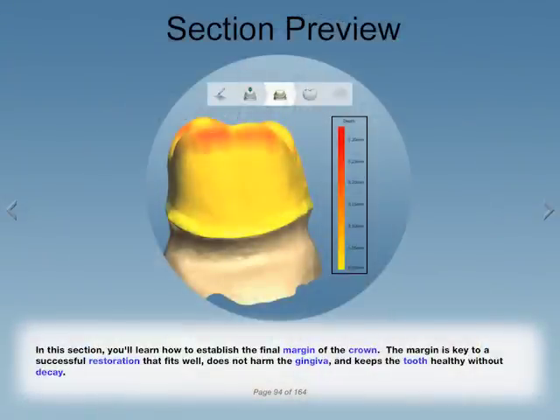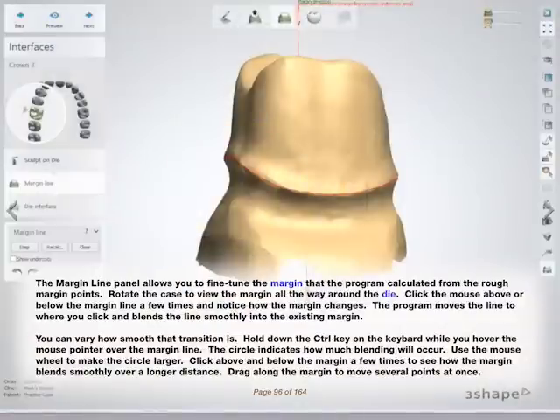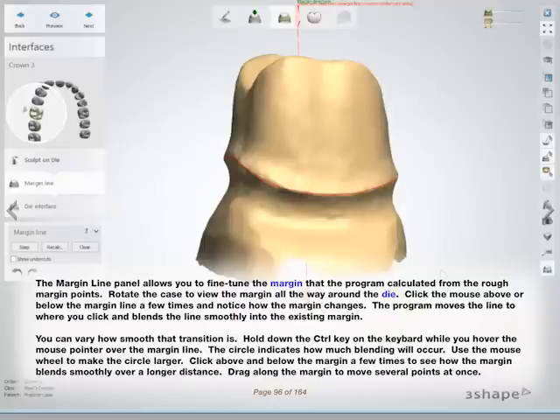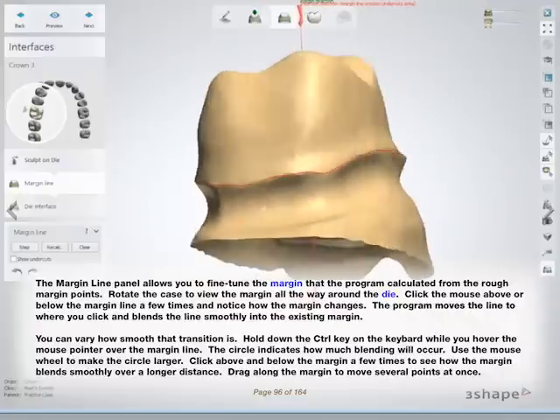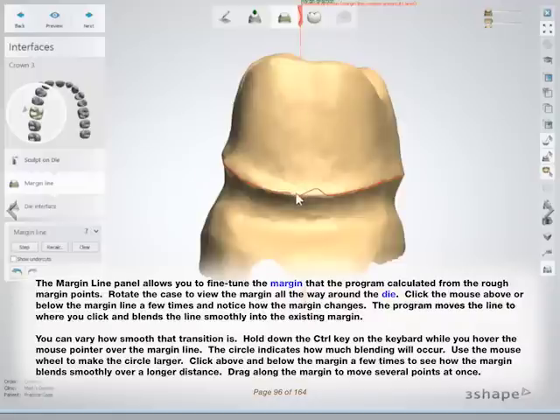In this section, you'll learn how to establish the final margin of the crown. The margin is key to a successful restoration that fits well, does not harm the gingiva, and keeps the tooth healthy without decay. The margin line panel allows you to fine-tune the margin that the program calculated from the rough margin points. Rotate the case to view the margin all the way around the die. Click the mouse above or below the margin line a few times and notice how the margin changes. The program moves the line to where you click and blends the line smoothly into the existing margin.